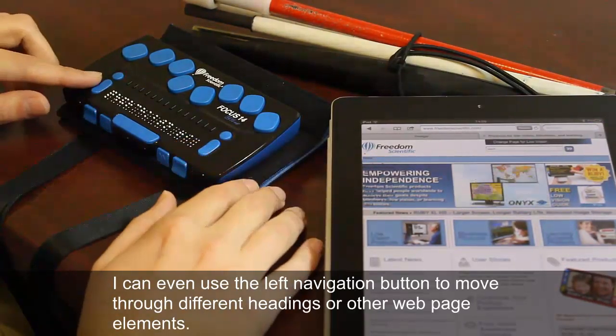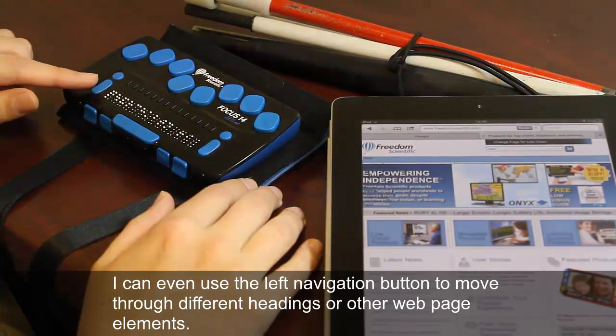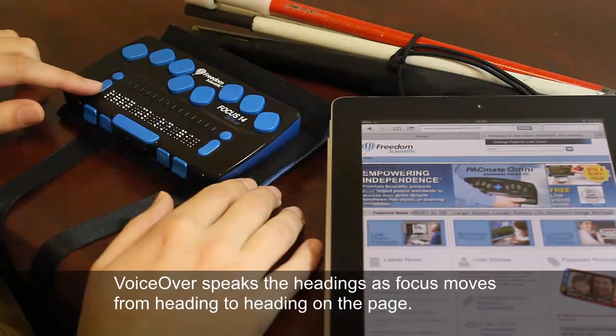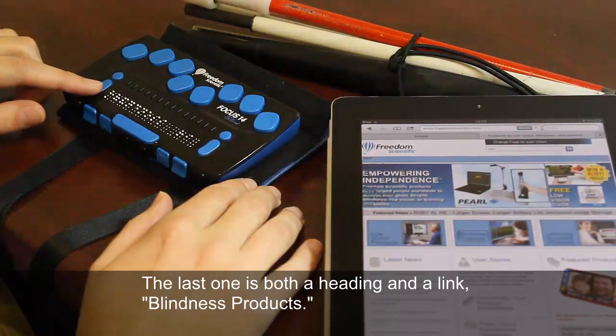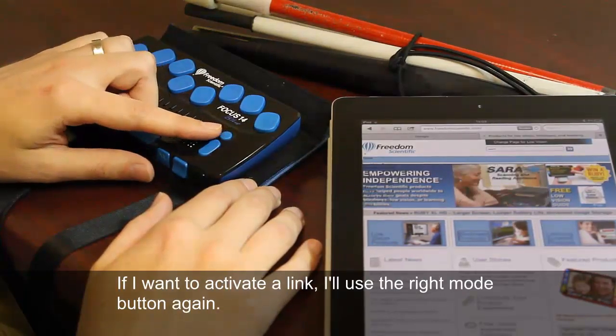I can also use the left navigation button to move through different headings or other web page elements. I'll move through different headings now: Ruby XL HD — larger screen, longer battery life, increased image storage — heading level 1; Low Vision Products, heading level 2; Blindness Products, heading level 2. If I want to activate a link, I'll use the right mode button again.